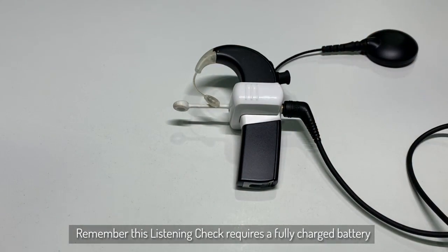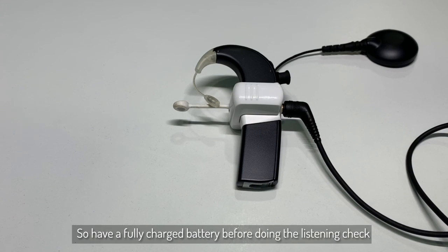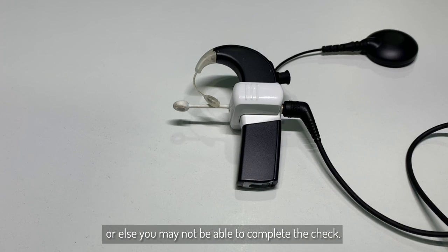Remember that this listening check requires a charged battery to function correctly. So remember to have a charged battery before you do this listening check, or else you will not be able to complete the check.